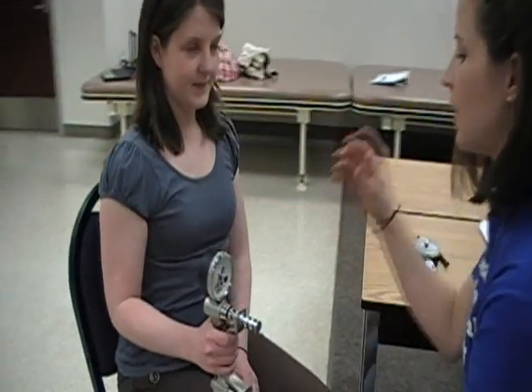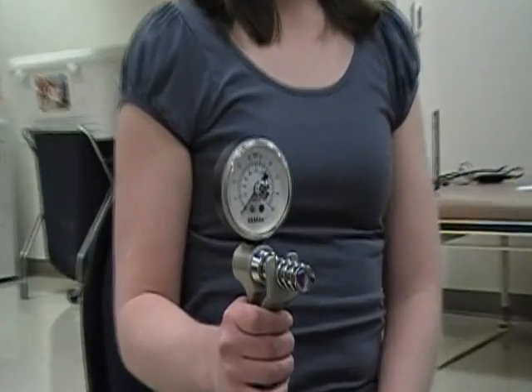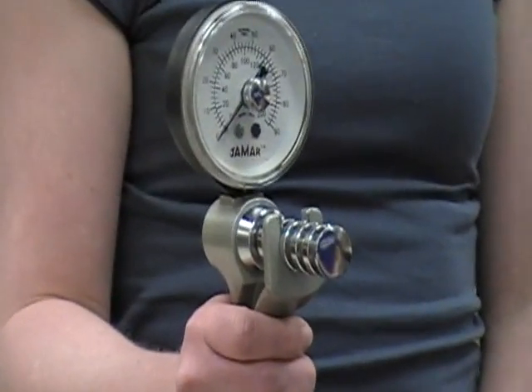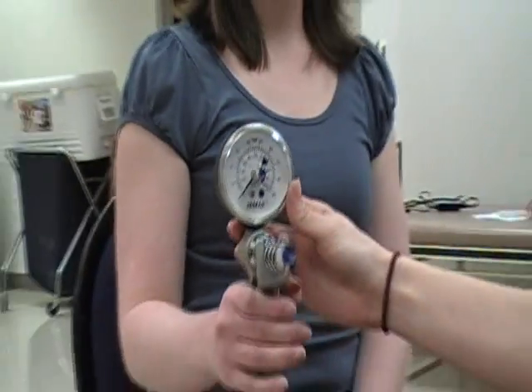Can you hold that for me? So Ms. Rachel Craft, what I would like for you to do is squeeze it as hard as you can. You would record this data and then do two more trials and take an average of the three trials together.